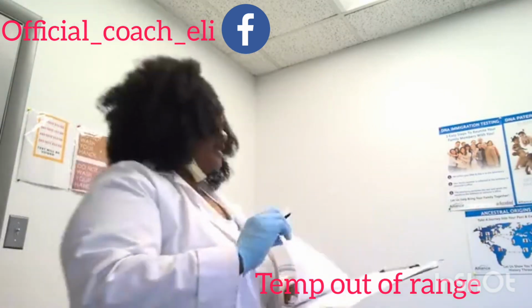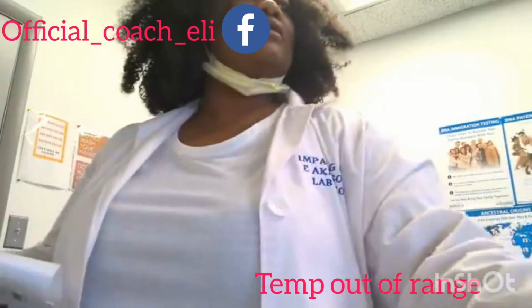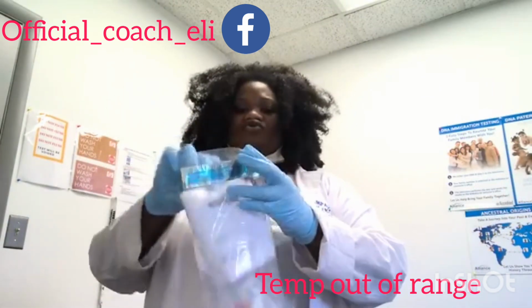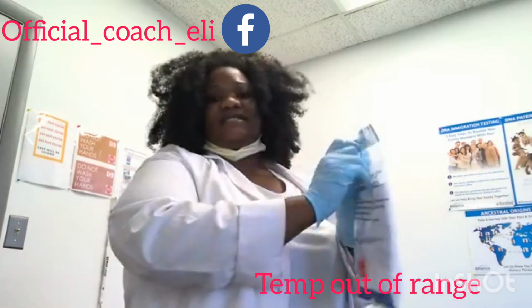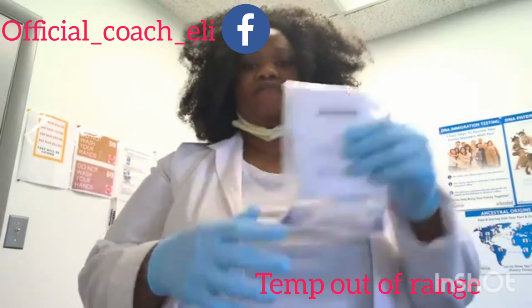All right. Once that's done, I'm gonna take this first copy, all right, and I'm gonna put it in the specimen bag. All right. Once it's here, I'm gonna go ahead and rip this off. She's going to put it in. With this. All right.